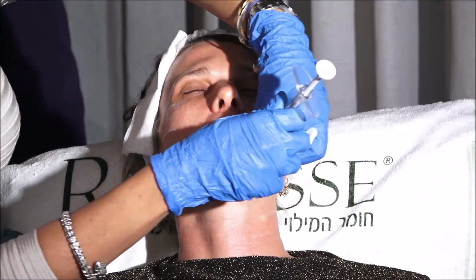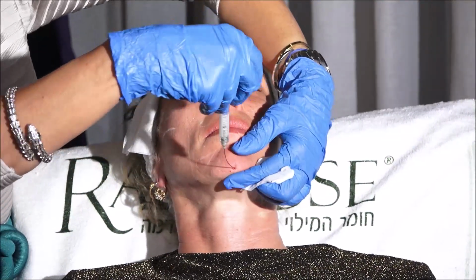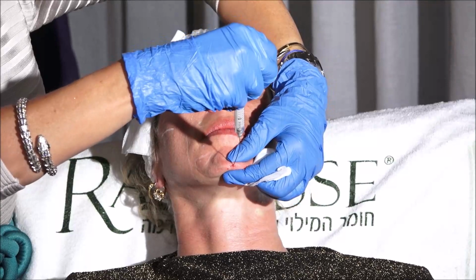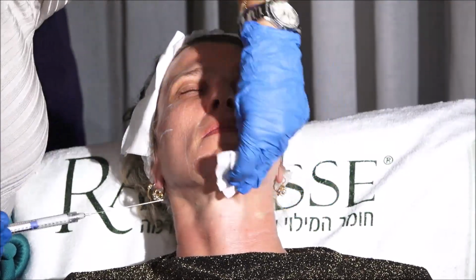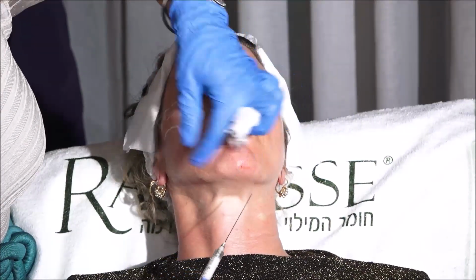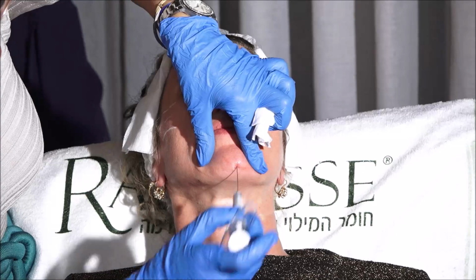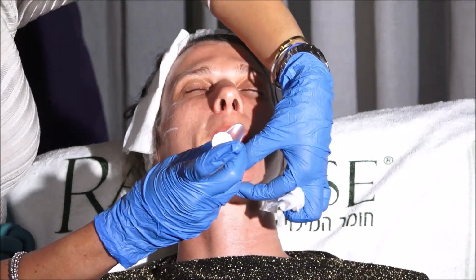Now, okay, now I'm here, directing towards the lower border. Pull the tissue up for the product to distribute. And then I'm going to blend both sides. So I did one bolus.